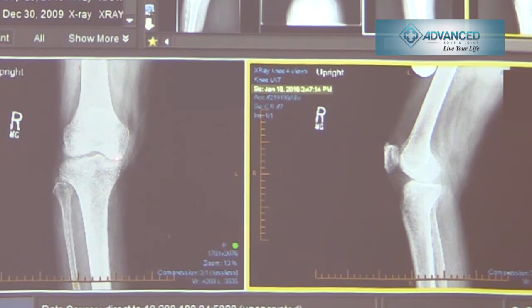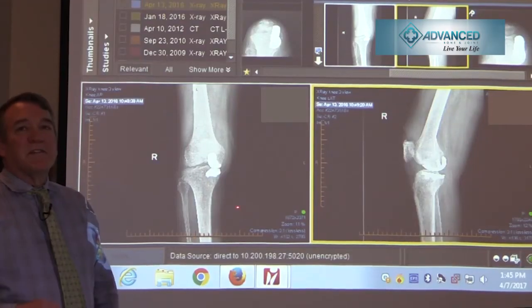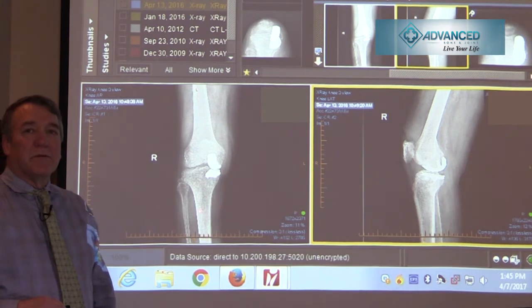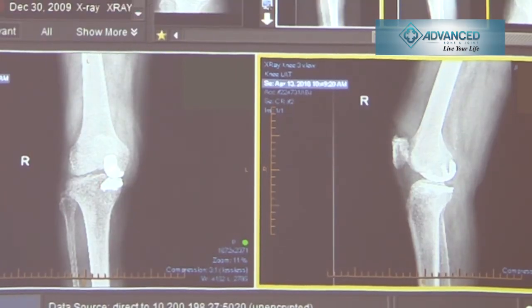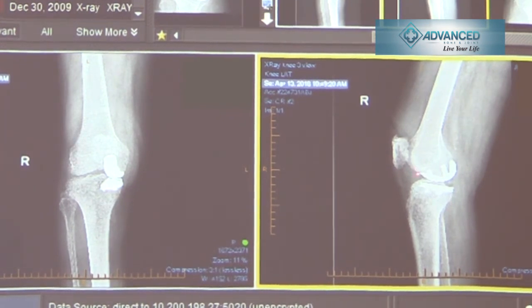As you can see, there is narrowing of the joint and some varus alignment or bow-leggedness in this patient. On the lateral view, we don't see significant osteophytes, but we know this has been degenerative in nature because this patient had a previous arthroscopy which showed one-compartment disease. Here's an example of the patient after a partial knee replacement — just the medial side of the knee has been replaced, with a small amount of cartilage removed and the femoral and tibial implants cemented in place with a small insert between the femur and tibia.